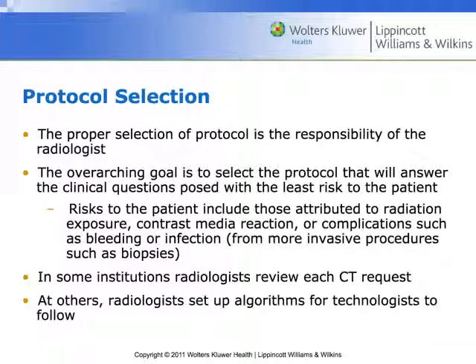Coben was asking, how do protocols work? Where do protocols come from? Really good question. A lot of times protocols are already preloaded into the CT machine, right? There are bad days when I have been known to say you could train a monkey to do my job, because a lot of what I'm doing is just putting people on a table, pushing a button, and go. But between pushing the button and go, the computer's telling the scanner to do a whole lot of stuff. I need to be well-versed on all of that, and there are a lot of different ways this can be maintained.